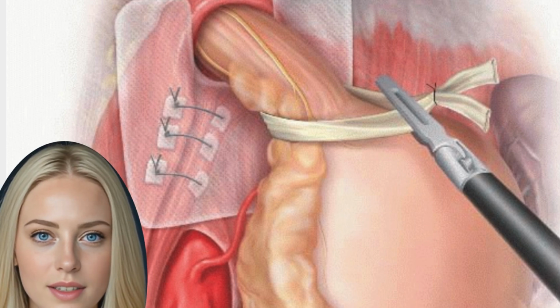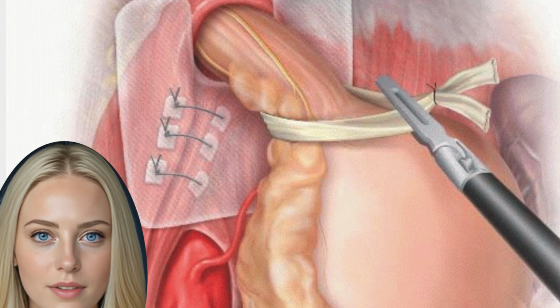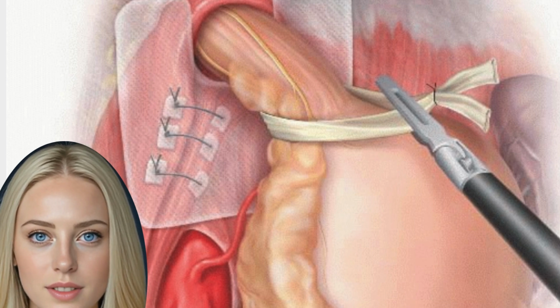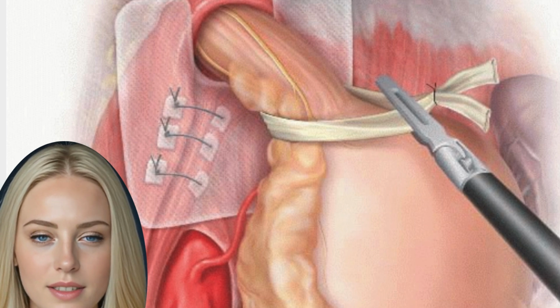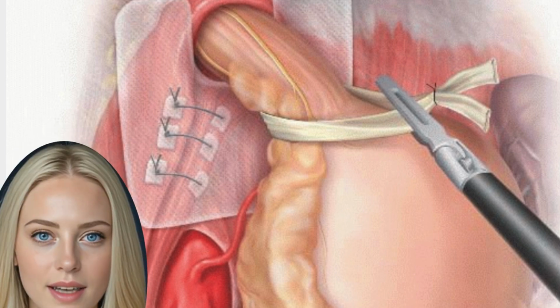Inadequate mediastinal dissection for esophageal length is avoided when the endothoracic fascia and pleura are placed laterally, and the mediastinal esophagus is visualized in a 360-degree fashion up to the level of the carina or right atrium, Figure 15. Fig 15, adequate mediastinal dissection as evidenced by 360-degree encirclement of the esophagus up to the level of the carina superiorly, endothoracic fascia and pleura bilaterally, and aorta posteriorly.